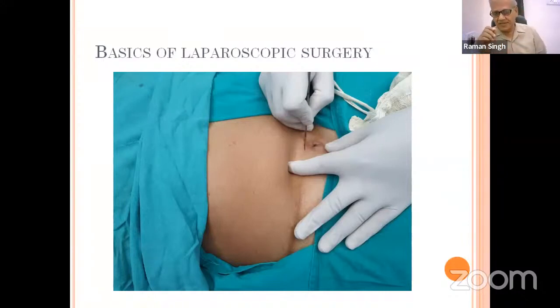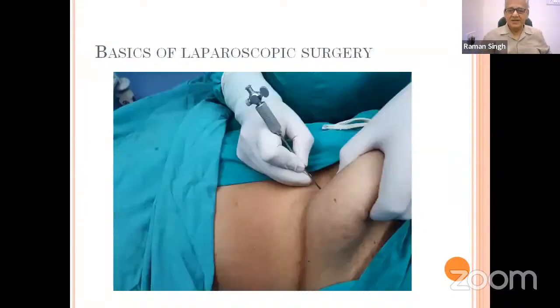At that place, you can enter your needle inside the abdomen. After giving a nick there, we insert this needle, and after feeling that we are in the abdomen, we put a drop of water over the tip of the needle. It is sucked into the abdominal cavity due to the negative pressure. This indicates that you are inside the abdominal cavity. This is the way you should hold the needle, and lift the abdominal wall upward to prevent any damage to the bowel.